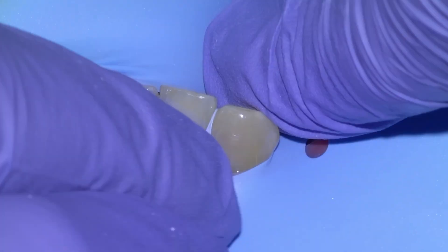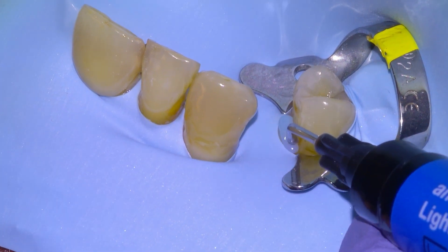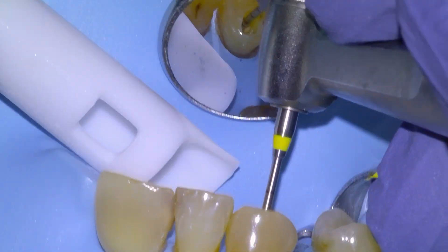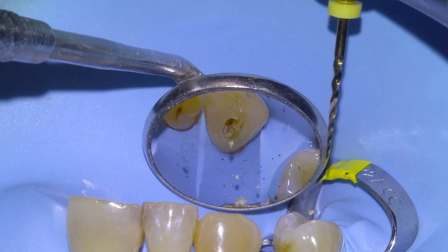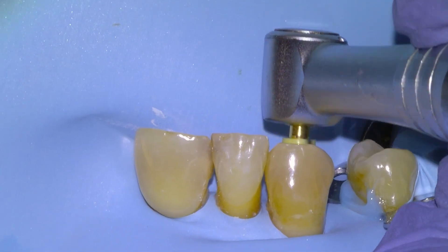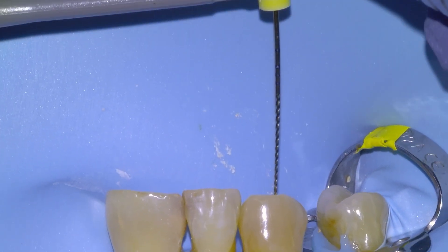I'm not a fan of single-tooth access when doing a root canal — I like to have room to work, so I'm going to extend the access two teeth to the left and two teeth to the right, using some liquid dam. We'll use a Munce Discovery bur to unroof the rest of the pulp chamber before going in with our first endodontic file. We're going to take our SX orifice-shaping bur, apply some RC Prep lubricant, and shape the orifice and coronal third of the root canal.